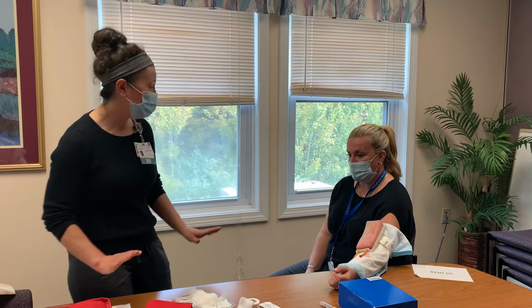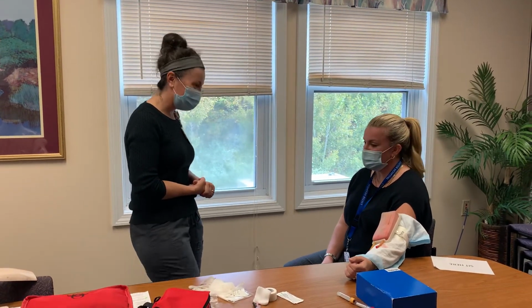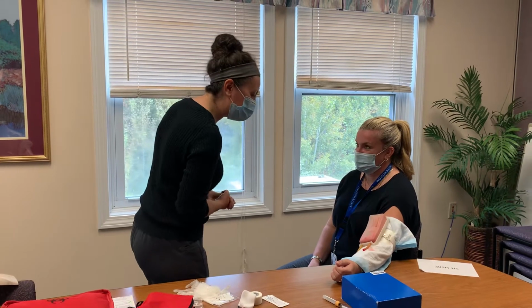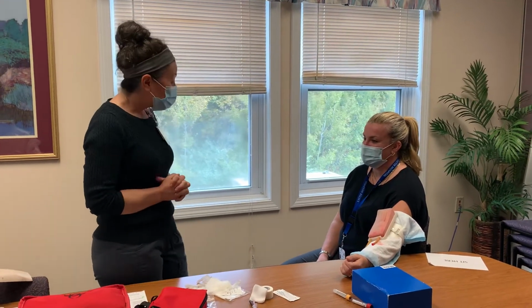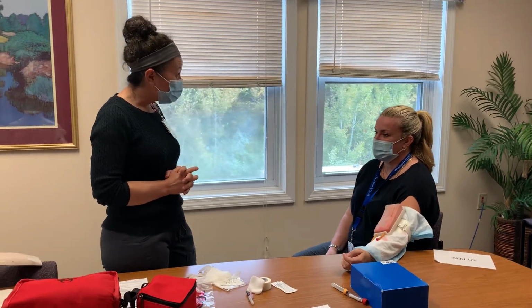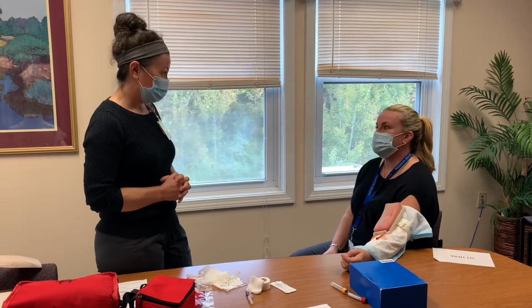Now, is there an arm that's usually better for you? My left. Your left arm? Okay. Yeah, I can see that you've got some good veins there on that side compared to your other side. Have you been drinking plenty of fluids like I told you when I called you this morning? Thank you for the reminder. Okay. Very good.